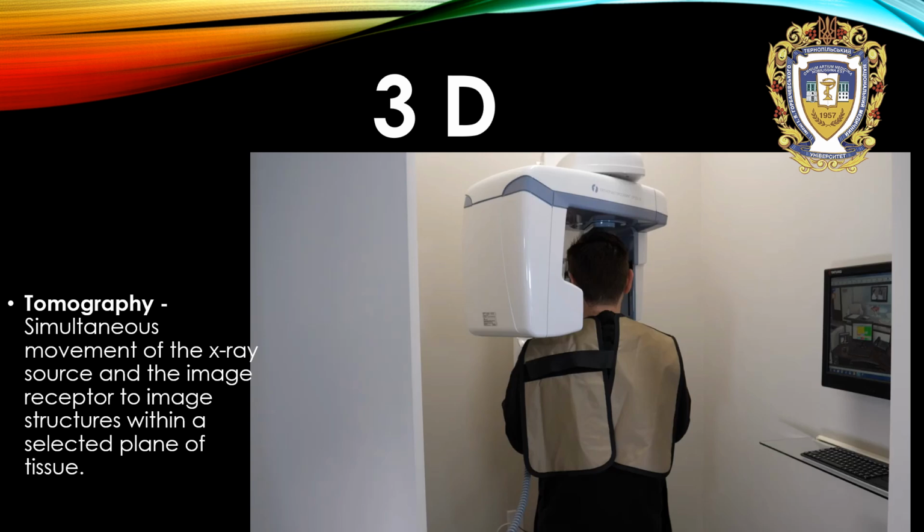And what kind of 3D methods can we use in dentistry and in medicine at all?